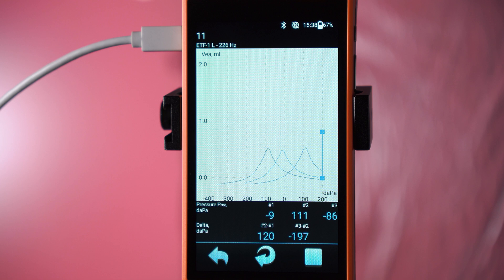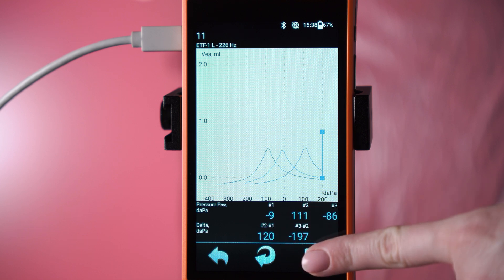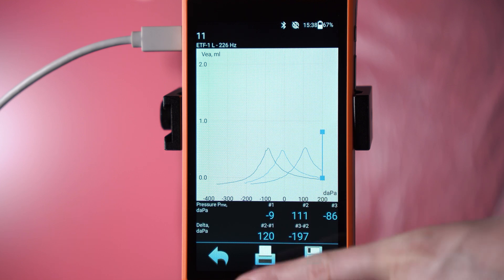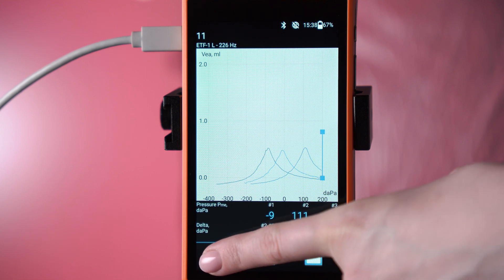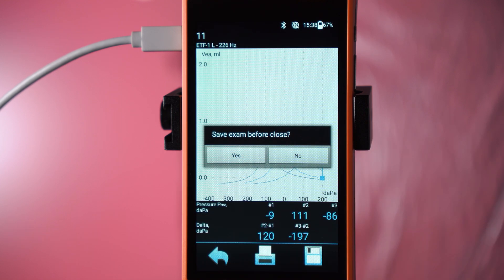After completing the examination, it's necessary to save the test results. Press the square and the floppy disk icon. If you need to print, press the printer icon. To exit the examination, press the arrow in the bottom left corner.